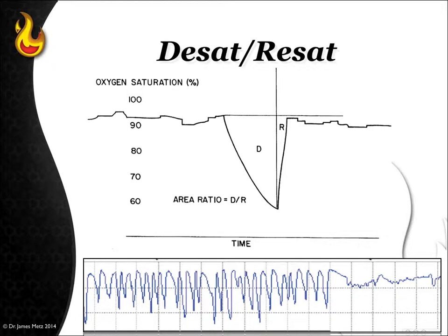physiologically possible. So the shape of that graph must be able to happen. If it drops too quickly, then we know that that's not a real desat, and it's just picking up movement, and this oximetry software will ignore it. So the graphing becomes very important as to determining the true nature of the desaturation as recorded in the SpO2.